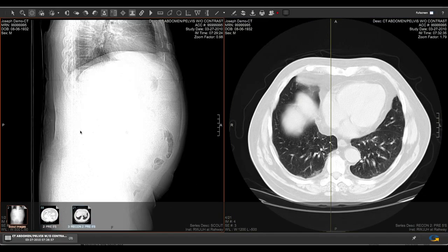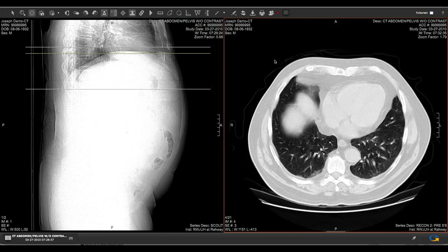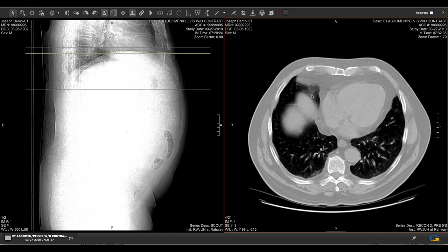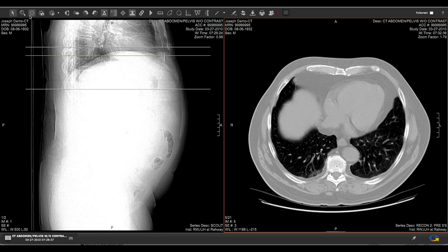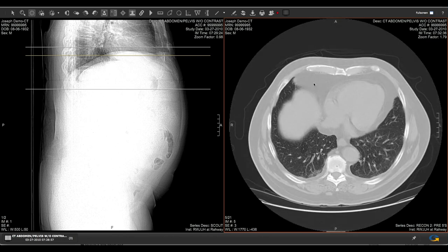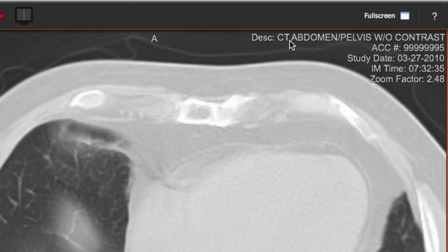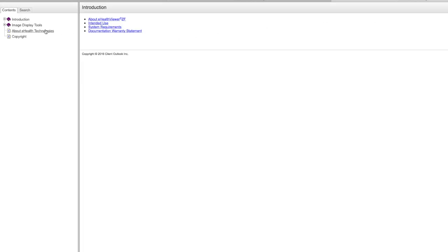The My Bay State Health image viewer contains the same tools used by your physicians. This tutorial will show you some of its most commonly used capabilities, but feel free to try out all the tools and browse the help files by clicking on the help icon in the upper right-hand corner.